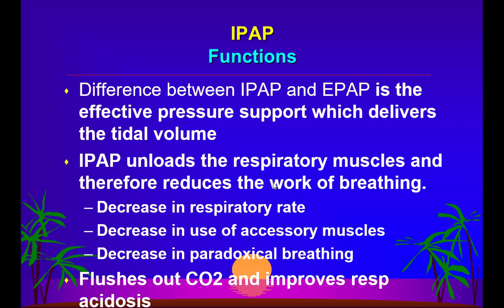Right, so these are the criteria by which you understand that the patient is requiring IPAP and his IPAP is adequately set. And when it is delivering a tidal volume, it is also helping washing out of the CO2 levels. So you find the CO2 levels are coming down. Alright. So IPAP may not be so important in patients of hypoxemic respiratory failure or say in congestive heart failure patients. IPAP would be useful only if the patient has got hypercapnic respiratory failure, which occurs in patients with COPD, obesity hypoventilation, neuromuscular disorders. I think you understand that?